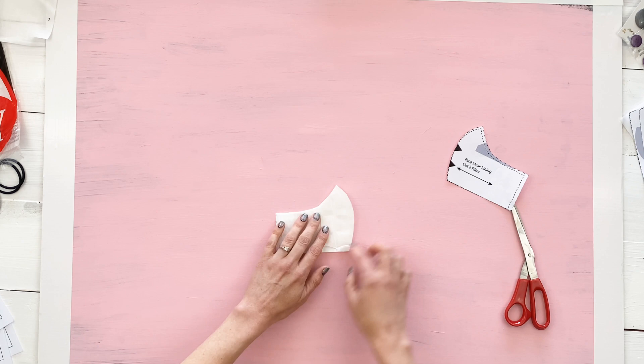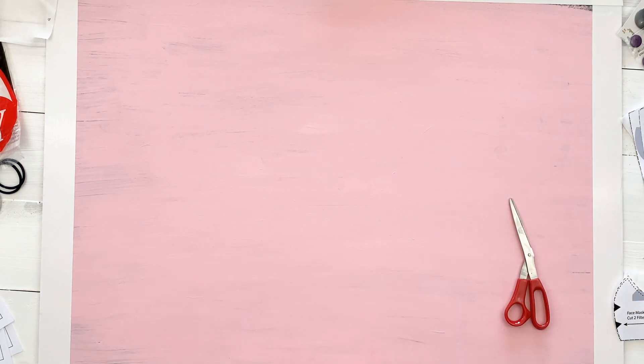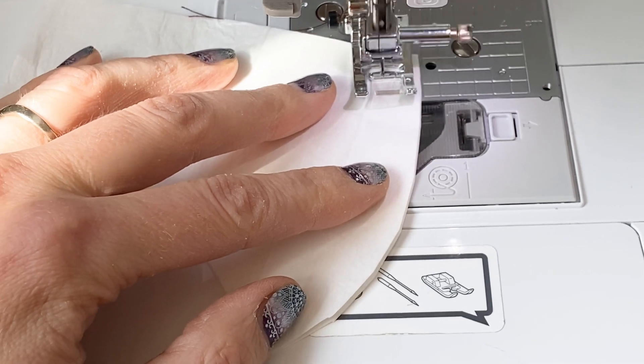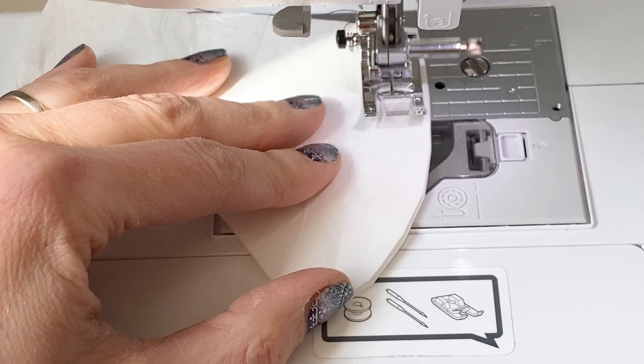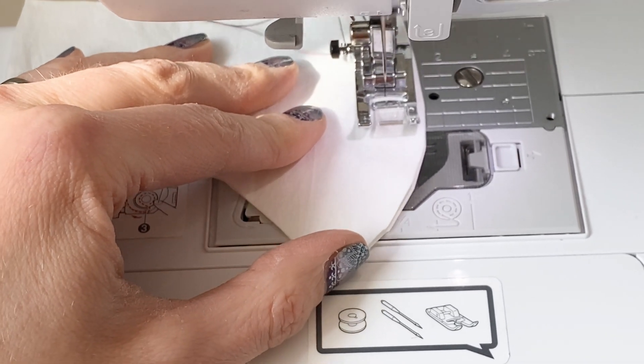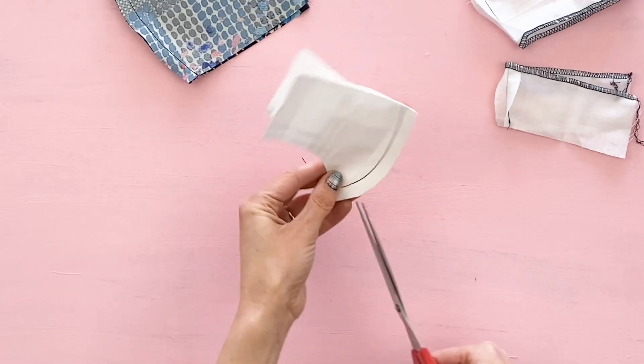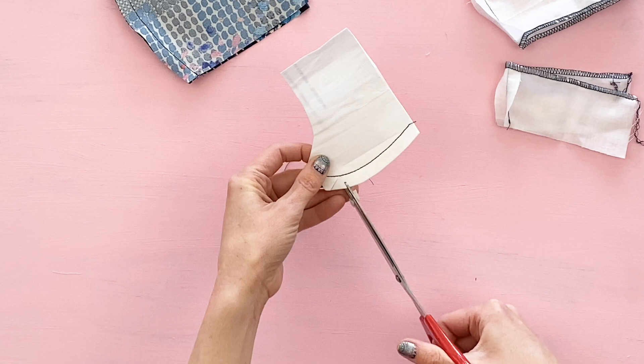After you've worn it a few times you'll want to switch out your filter, whereas the rest can be washed in a washing machine. When you're sewing your filter, extend your stitch length to about 3.0 and use a smaller needle if you have one on hand.